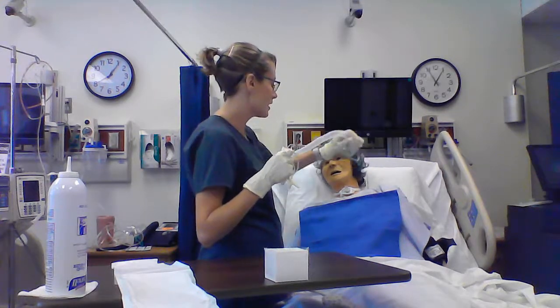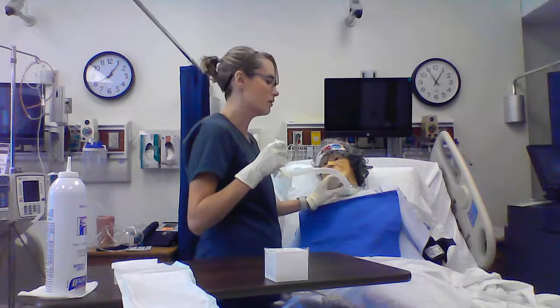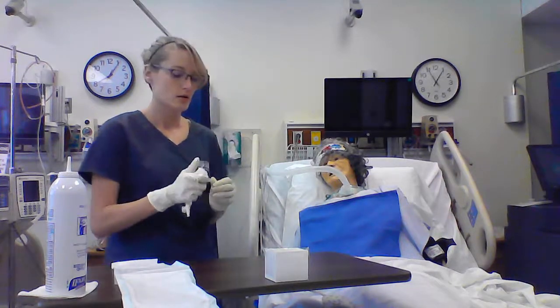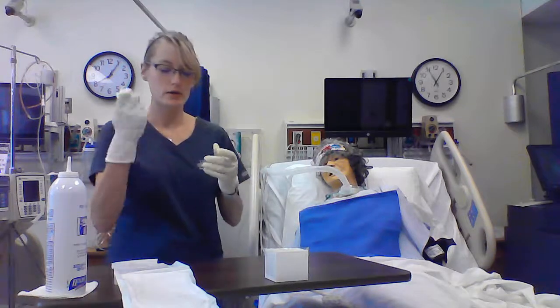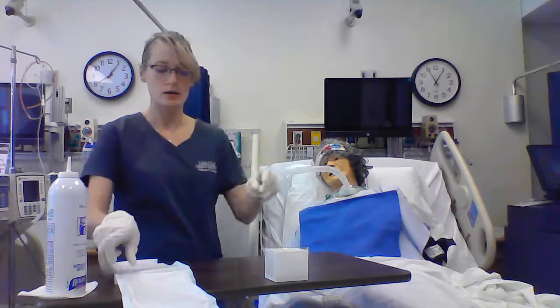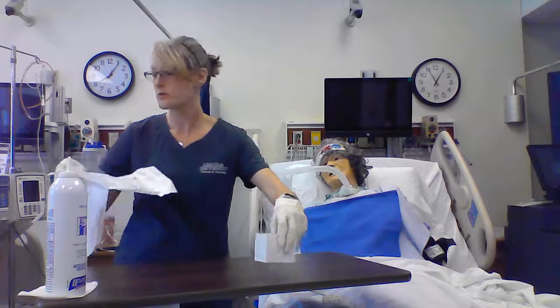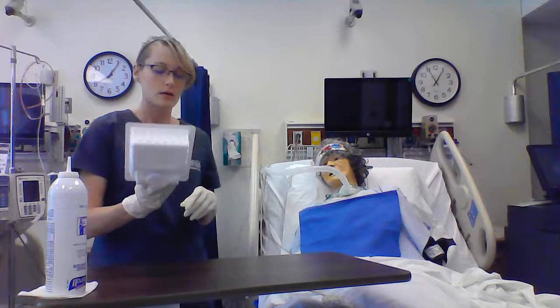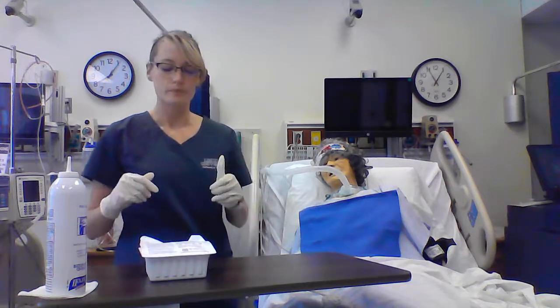I'm going to take her oxygen mask and put it back on and let her recover while I set up for the next portion. So I'm going to clean up my field here. This would go in the trash with my gloves. This would all go into the trash can. For the sake of the video, I'm going to set it over here. And I'm going to grab my trach care kit.